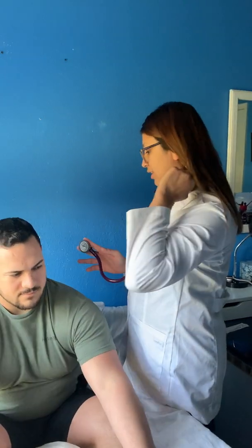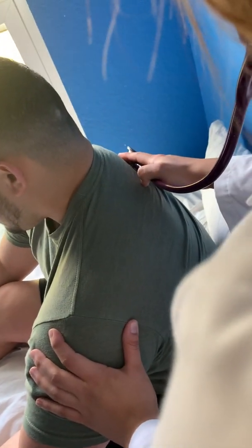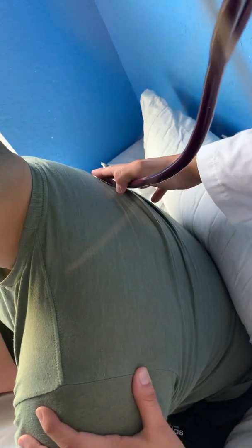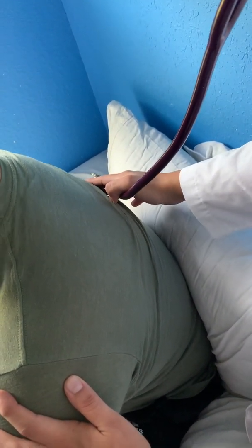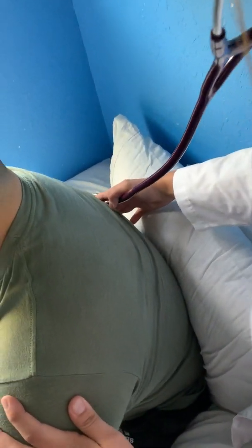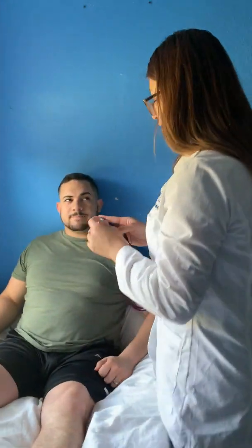Now if you can move forward just slightly. Great. I'm going to be listening to your back side. Take a deep breath. Good. Deep breath. Deep breath. And then two more times. Good. Good. You can lean back. No adventitious lung sounds noted. Are you feeling okay? Any dizziness? I'm fine. Maybe from breathing so much, but I'm fine.